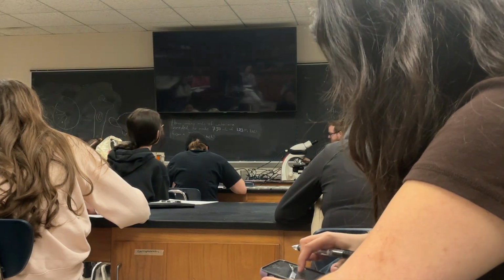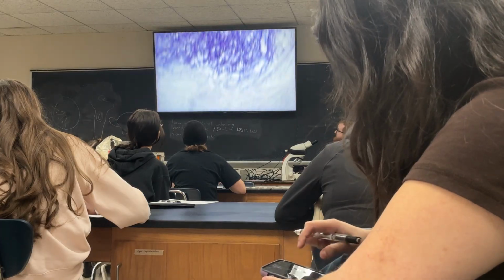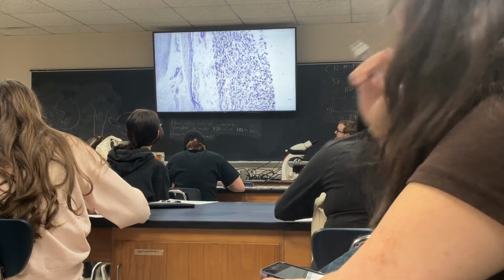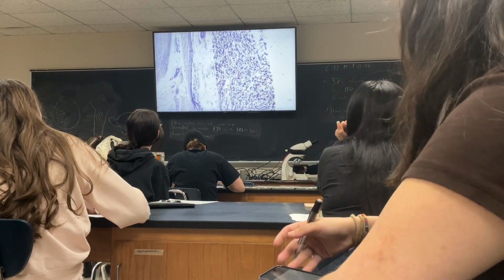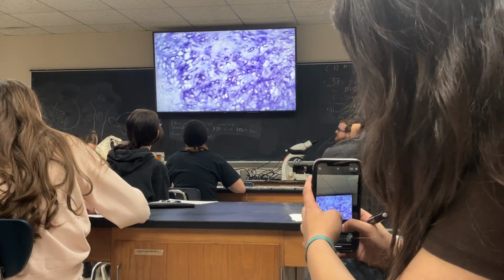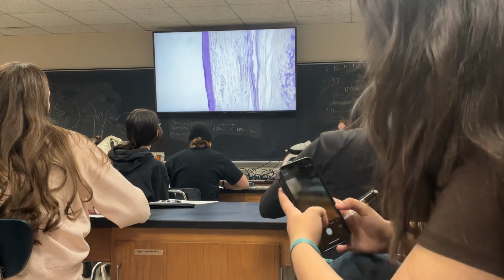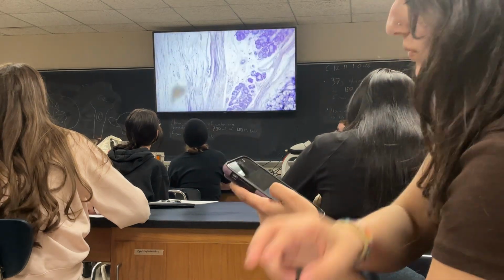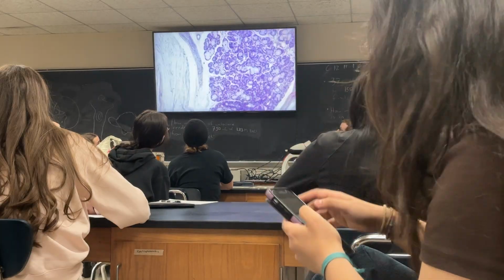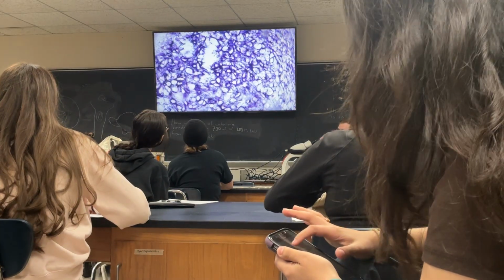Now this slide is called elastic cartilage. Like we talked about last time, maybe what that means is you get zoomed in and you're looking out here and you want to say, hey, here's elastic cartilage. That's not elastic cartilage, right? So you still need to go find what you're looking for to look more like that. Right, there's some type of epithelium. There's some salivary glands, right? So maybe you zoom in and you say, well, that looks like something interesting, and it is, but it's not elastic cartilage, because that's what elastic cartilage is.